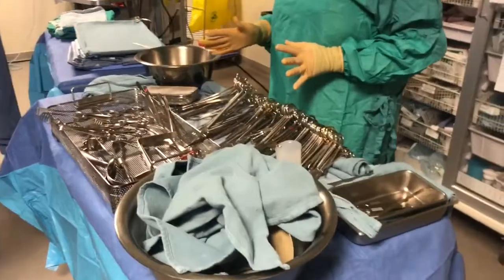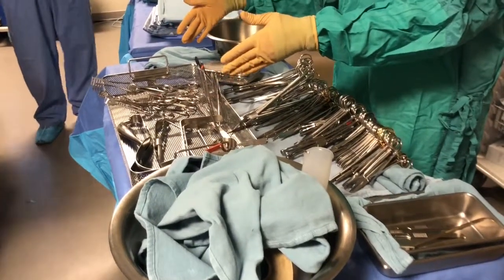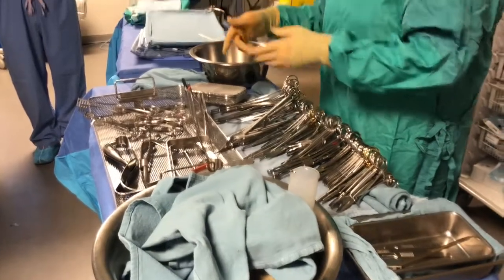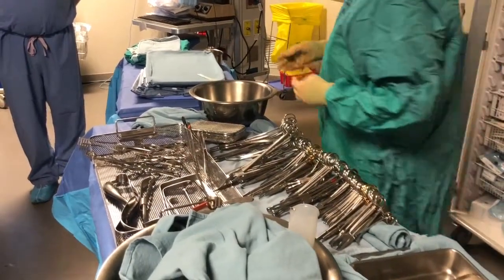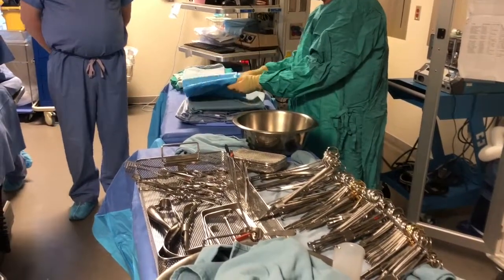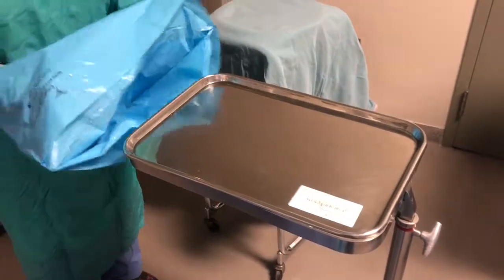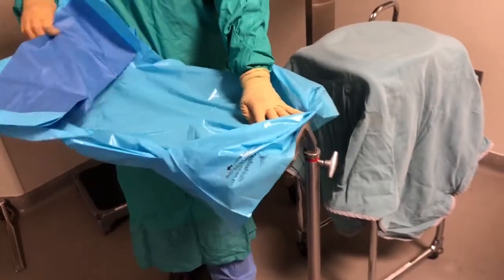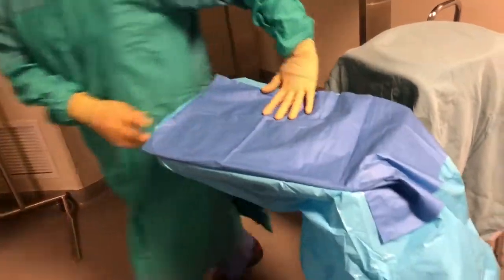So I don't care which one you take out first. Probably because we have more small stuff. I probably should have done it the other way around, done the small one, and then just sorted my small stuff, because there's only actually a few big instruments to go in here, but it still worked out fine, right? All right, so now I'm going to drape my mayo. And you guys remember how to do this? Okay, so make a little pocket. And then if you stand a little bit to the side, you can actually grab a hold of the end and just twist it. Okay? Tuck it in. And then this can go right on top.